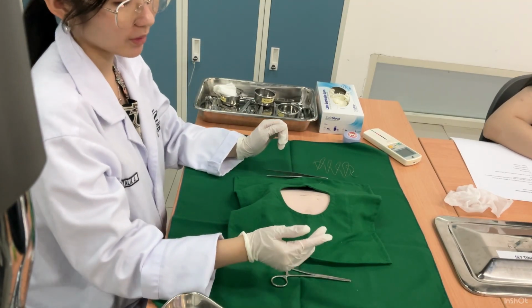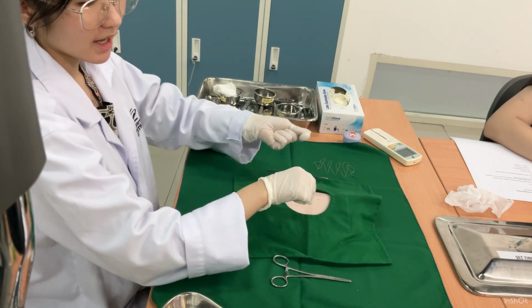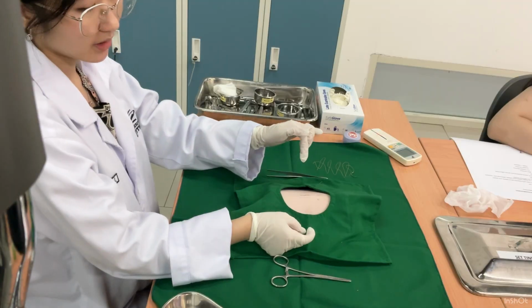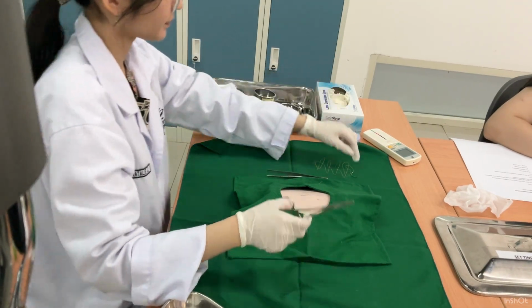Okay, so for this type of suturing, the needle will be inserted into the far edge of the skin on the first side of the wound, and it will cross the wound and skin on the other side, then out into the far edge of the skin on the second side here. And then the needle is gently inserted back in the front edge of the skin on the second side, and it will cross the wound and roll back out in the near edge of the skin on the first side. So I'll begin now.